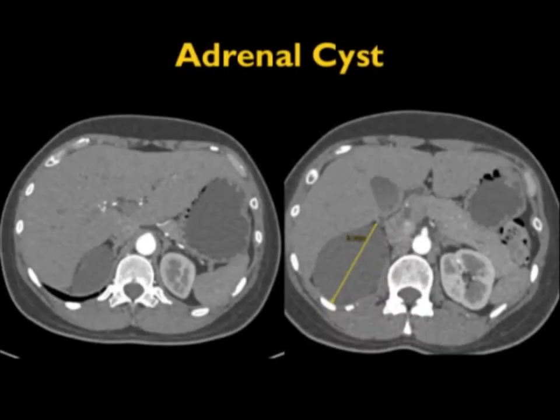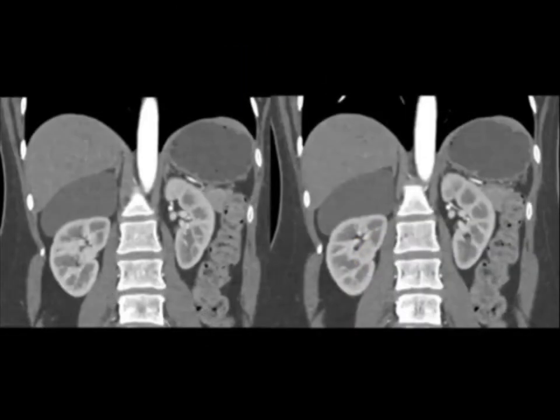Adrenal cysts are typically water density. Here's another example — they typically will push down on the kidney. Very nice example.